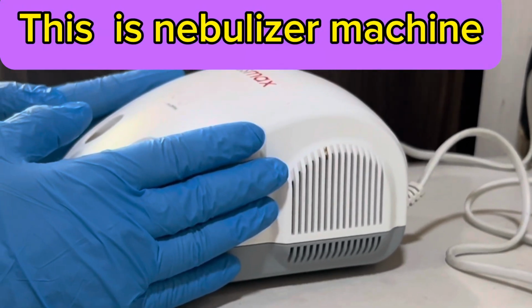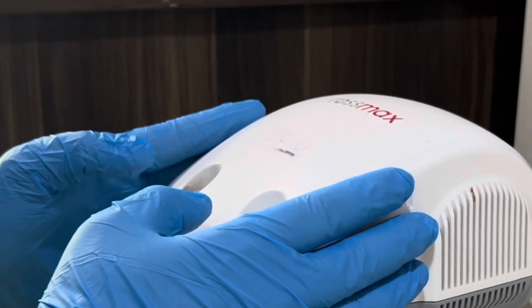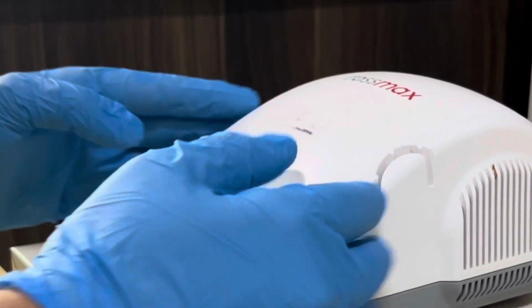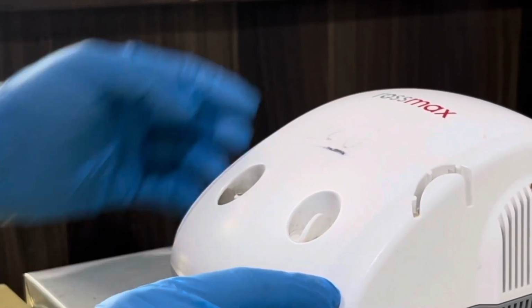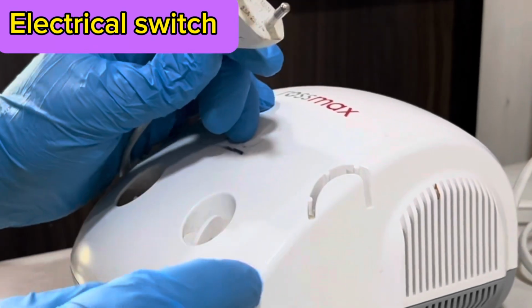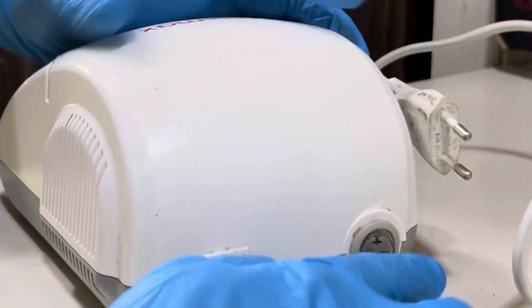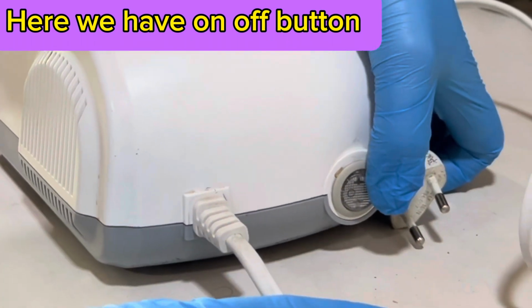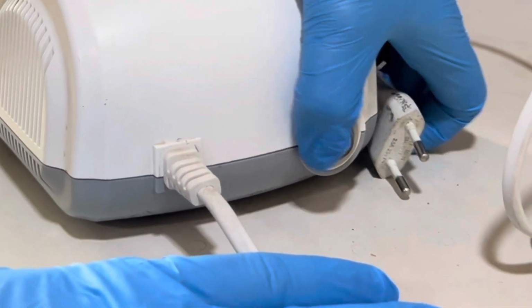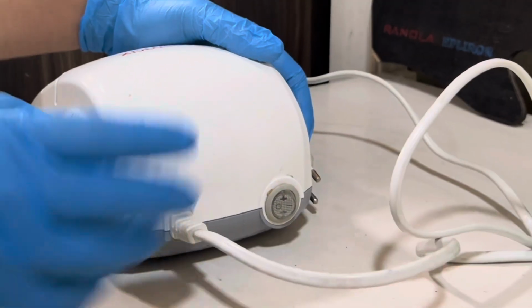Now this is a nebulizer machine. Look in these pictures, you can see clearly. After that, this is the electric switch. Here is the electric switch. From here we can turn the nebulizer machine on and off. From this side, on and off the nebulizer machine.